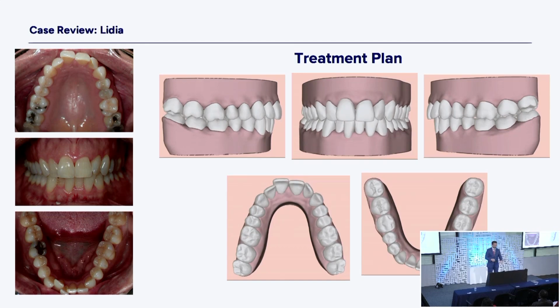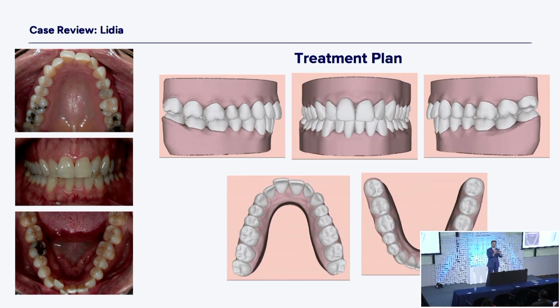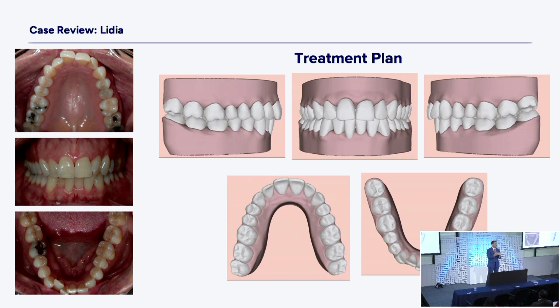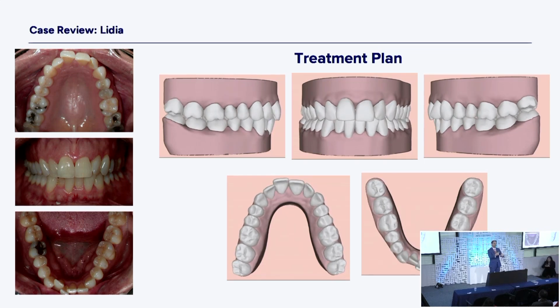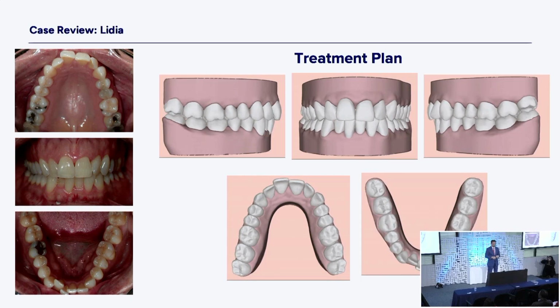And if you don't see those things conquered in here, you write back. It's okay to put the reject tab and write a little note. I would like to develop a wider arch. I noticed that there's some IPR here. Please expand it away. So you have little things you can write to guide a little more expansion.